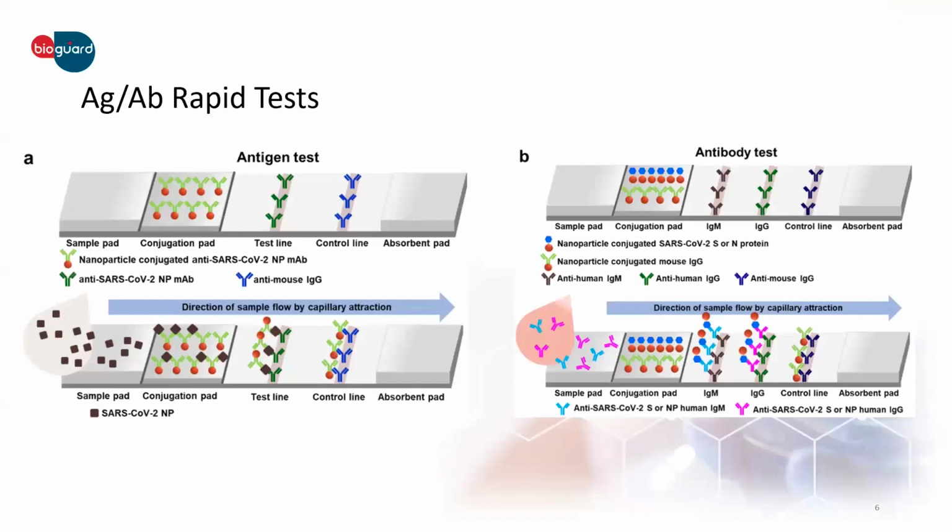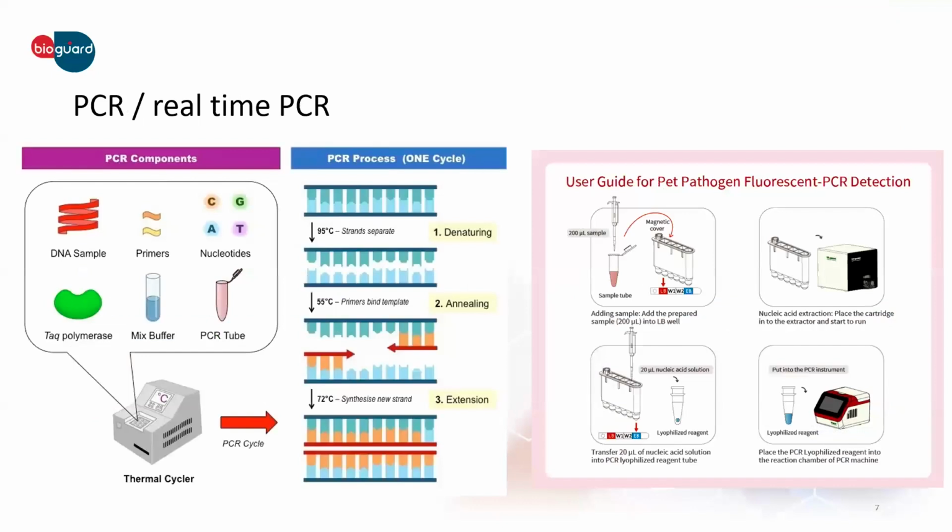Let me elaborate on how the antigen test and antibody test work. We are not going to go into the detail. I think after the COVID-19 pandemic, most of us are already familiar with the antigen and antibody rapid test.